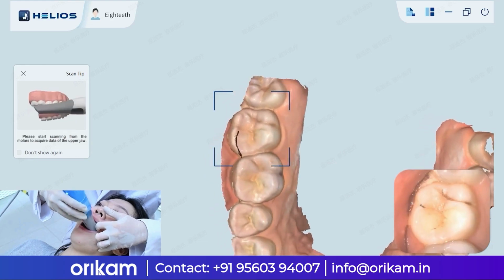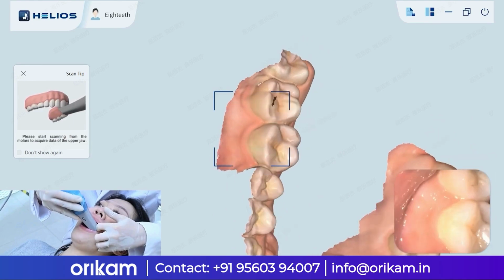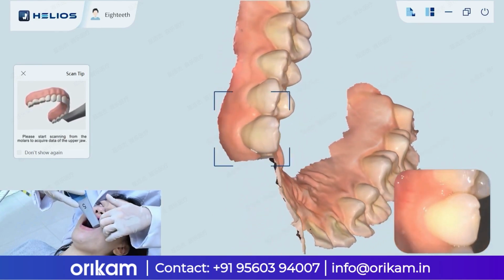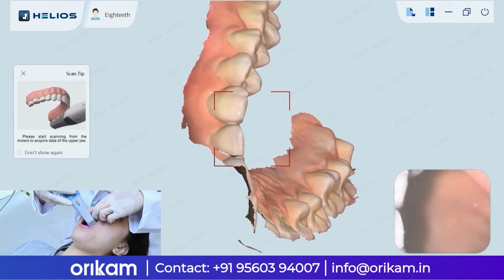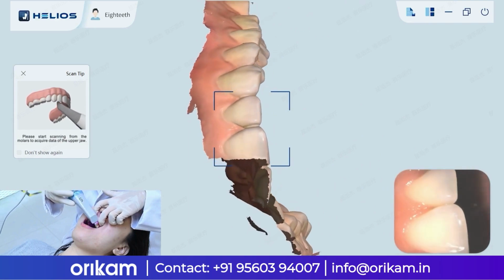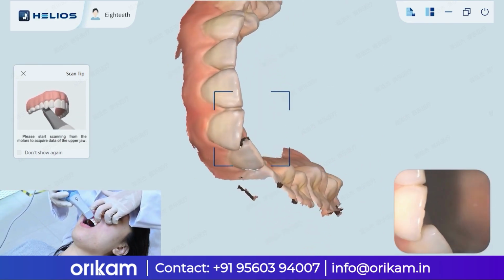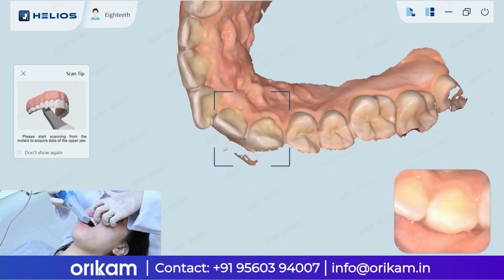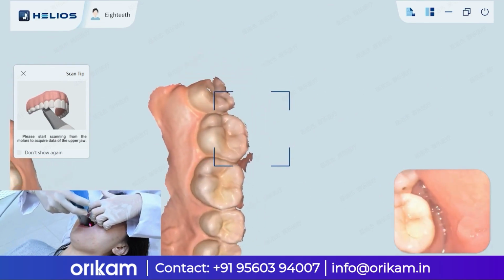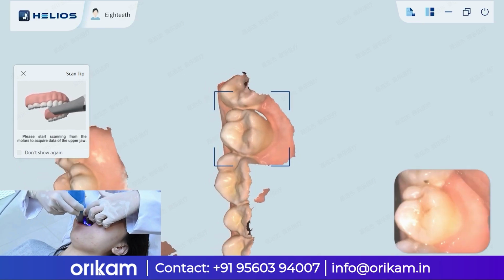As you transition from the lingual side to the buccal side, you can use your hand to assist by pushing aside the buccal mucosa and pulling the lips. When scanning the anterior teeth, you can use a mouth mirror or your fingers to pull the upper lip to ensure smooth scanning. Return to the occlusal surface of the posterior teeth, then switch to the buccal side for scanning.